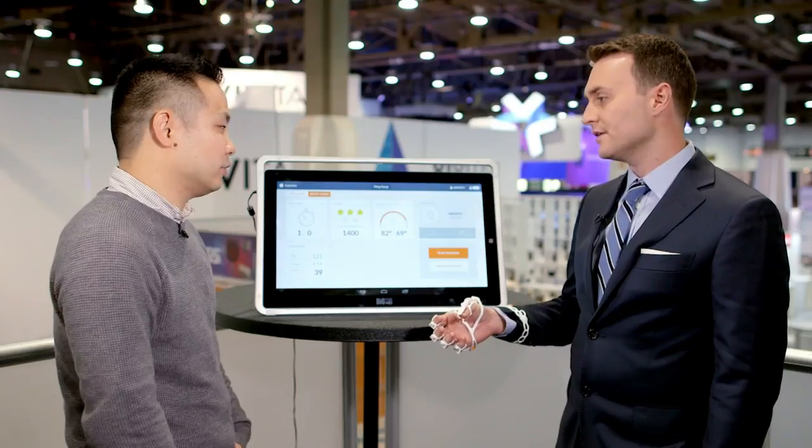How much does it cost to use this device and the service that comes with it? Of course, $99 — $99 a month to rent the device.